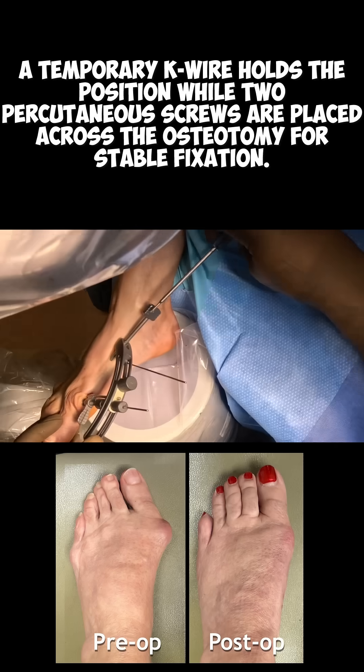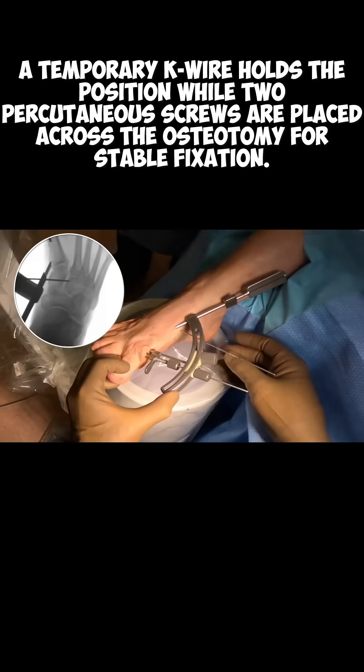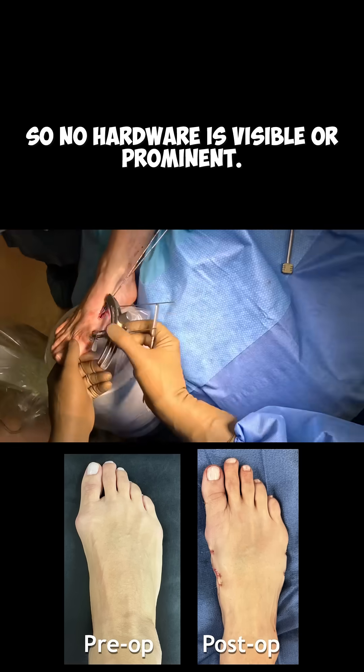A temporary K-wire holds the position while two percutaneous screws are placed across the osteotomy for stable fixation. These screws are fully buried in the bone, so no hardware is visible or prominent.